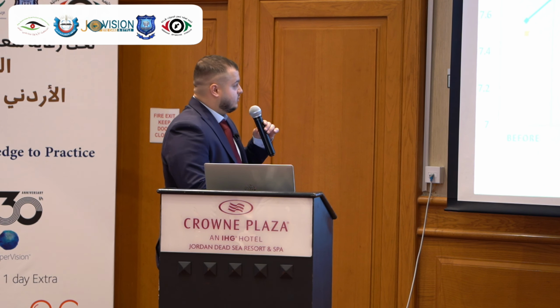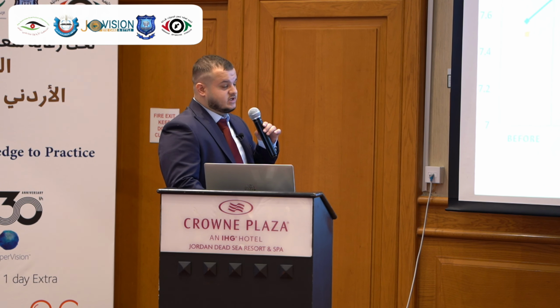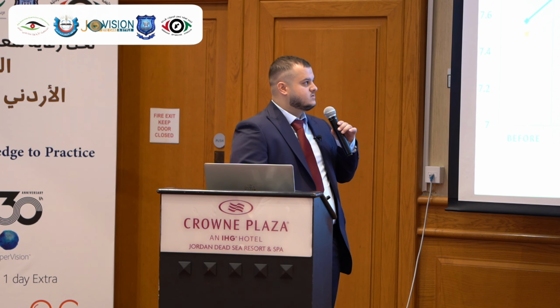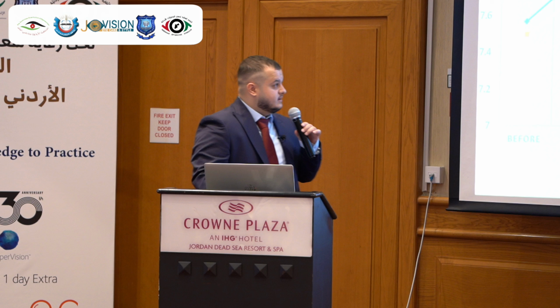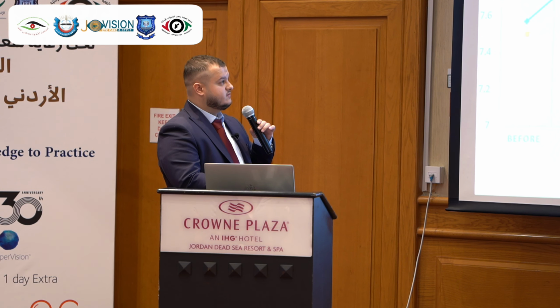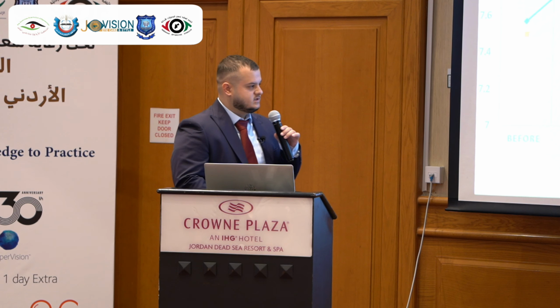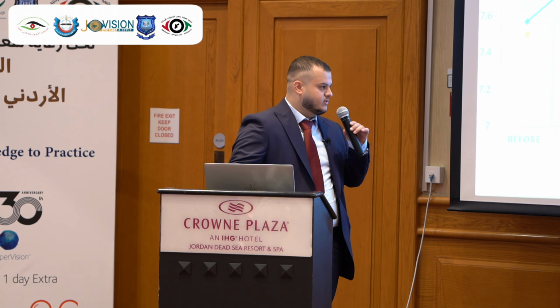The patient started at 7.5 average, and in 1 month there was rapid change. After that, stabilized or slightly changed K readings. The same thing with spherical equivalent. The patient started at minus 2.75. In the first 1 month there was rapid change. She is near minus 0.75, and now she is near emmetropic, minus 0.25.